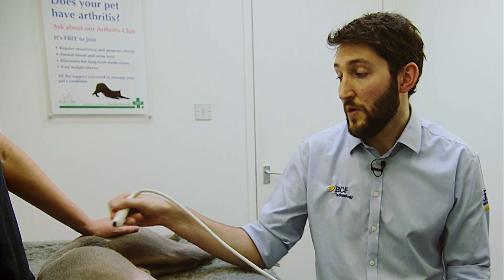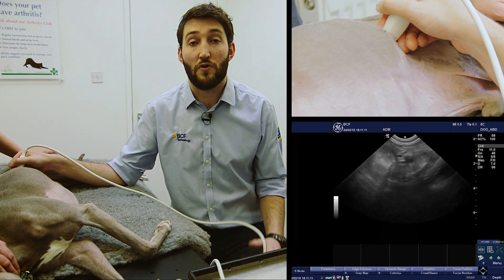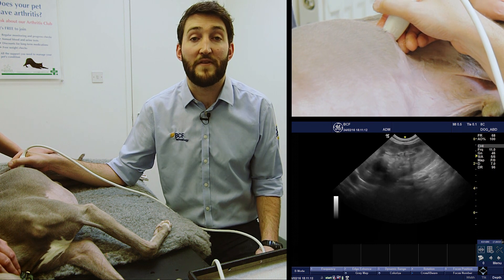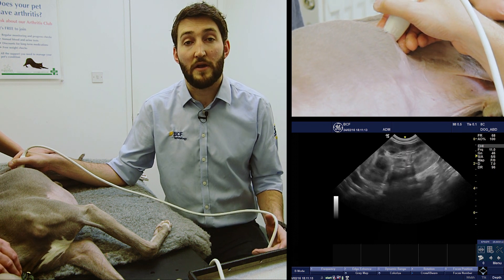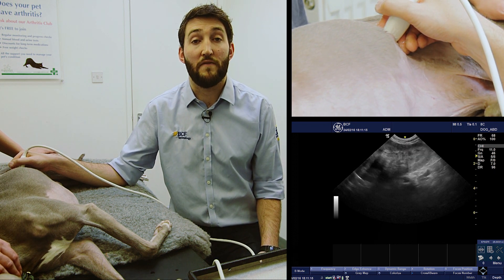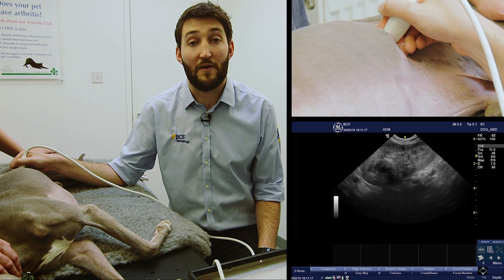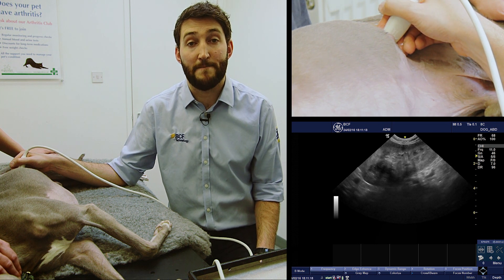To start, we're going to find the left kidney as we've done before. If you're not sure about finding the left kidney, please have a look at our previous video on how to image the left kidney.